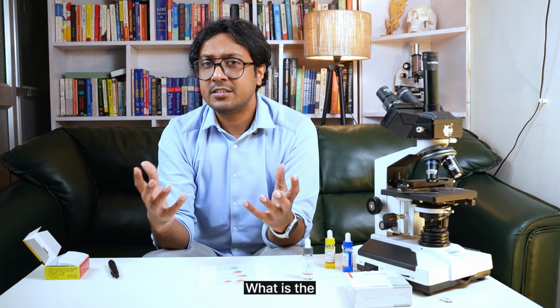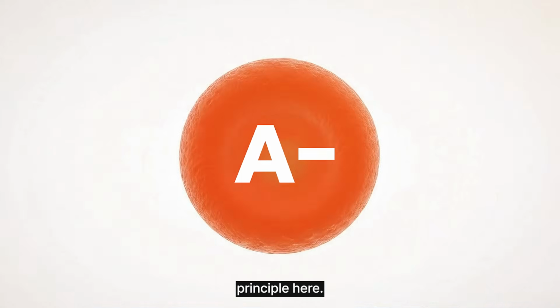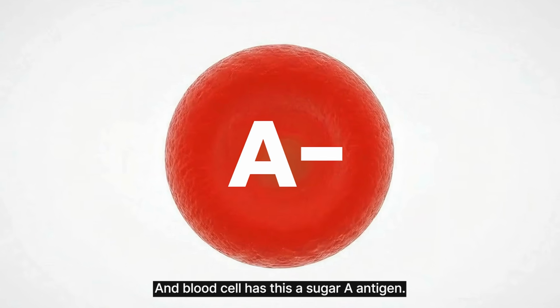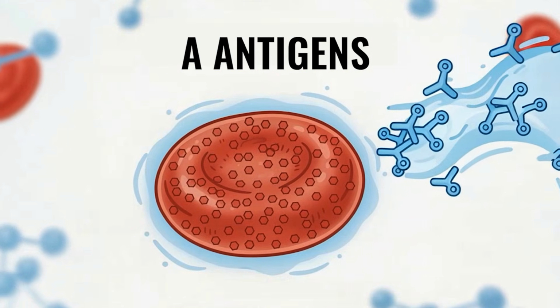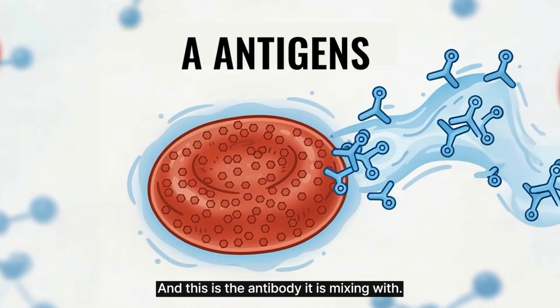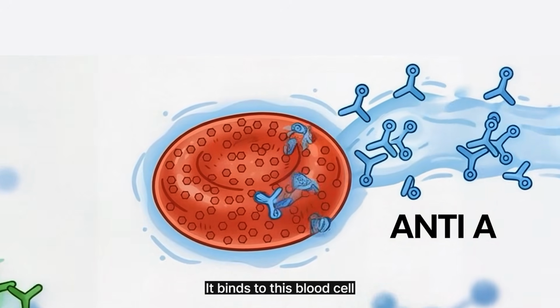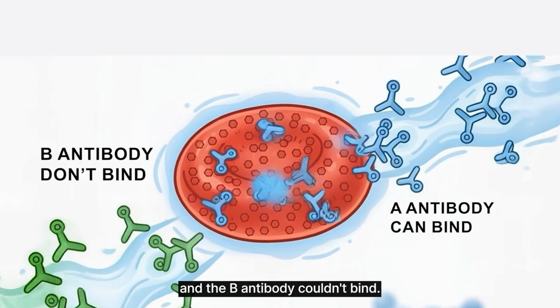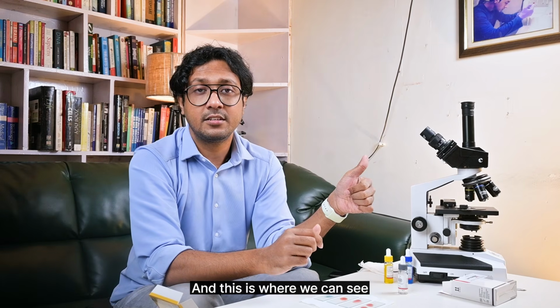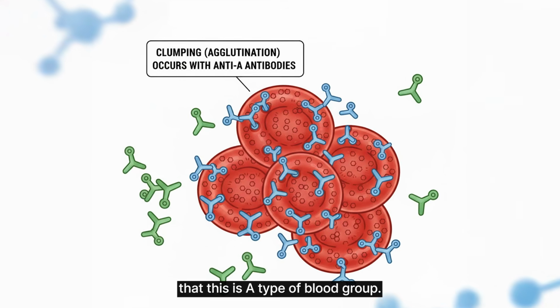Now what happened? What is the principle? Here, this is the blood cell, and the blood cell has this A sugar, the A antigen, and this is the antibody it is mixing with. It binds to this blood cell, and the B antibody couldn't bind, and this is where we can see that this is A type of blood group.